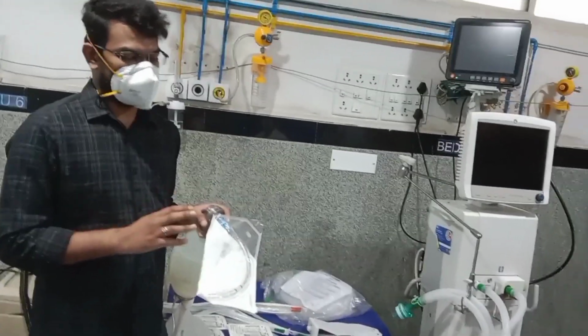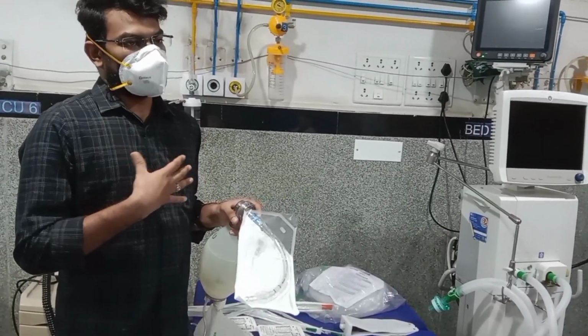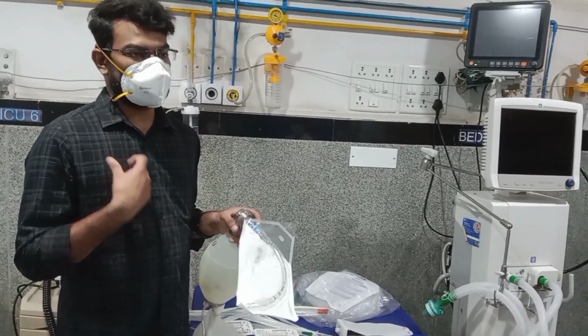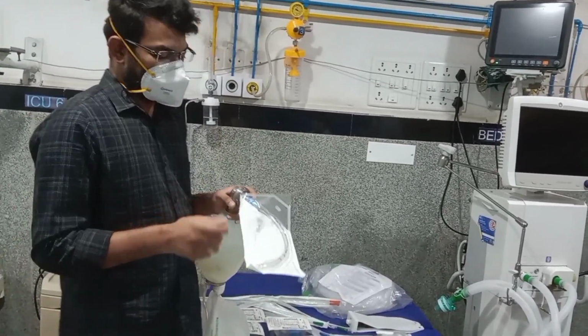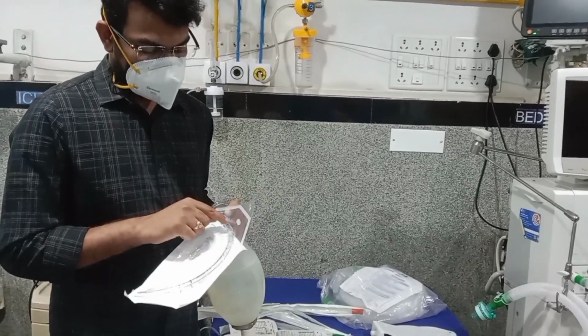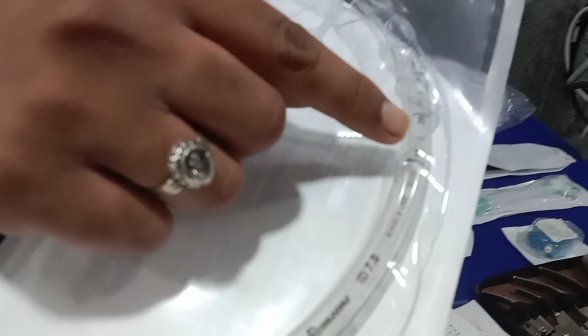You have to make sure that the tube is in the correct position, so that the lung or the rib cage expands evenly. So both sides of the lung should be seen and ausculted properly. Once you see that the airway is clear, you should fix the tube. The markings are here on the ET: 18, 19, 20.